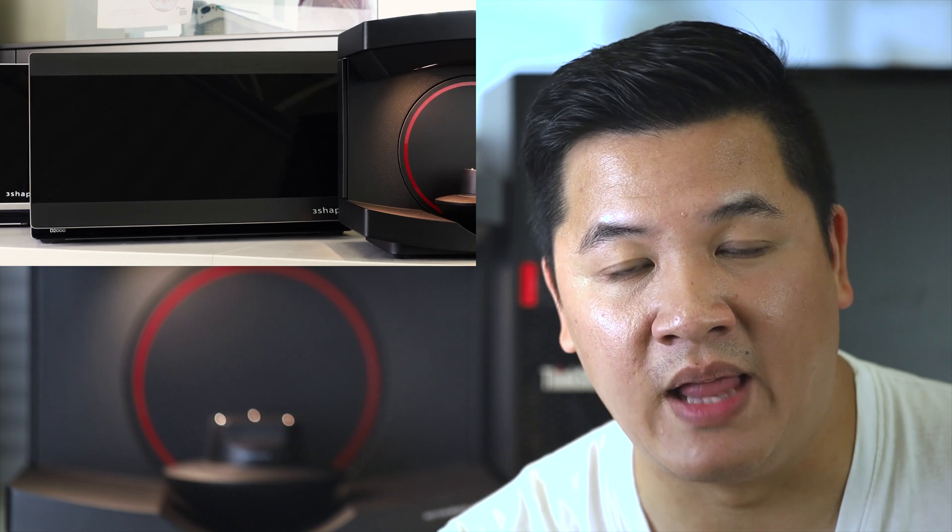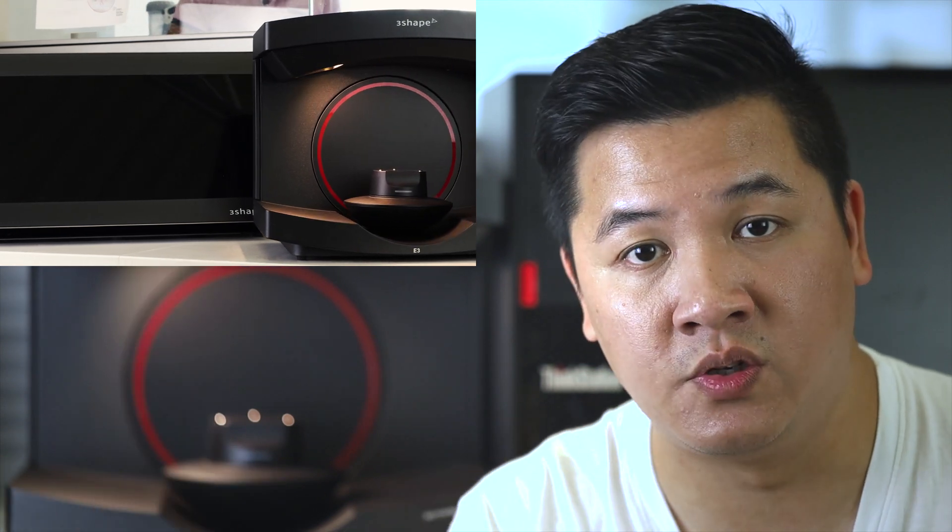The next thing I really like is the open platform. It's a little bit of a novelty, but as someone who's only ever used D-Series scanners — where they're kind of a mystery black box that you put the model inside, close the door, and the scan pops up on your screen — with the open platform of the E-Series, you get to see the model moving. It's a little more interactive, a little more fun, more involved. But moving beyond the novelty factor, the open platform does actually offer more versatility and flexibility compared to D-Series scanners.